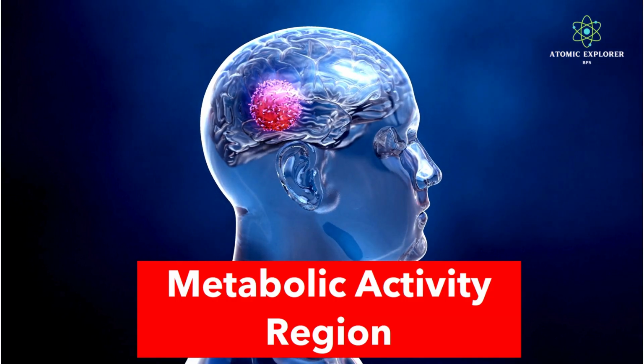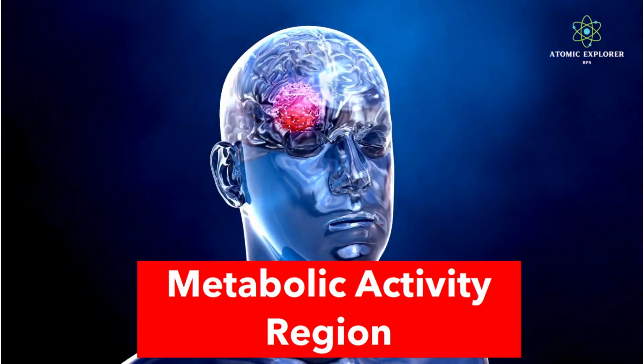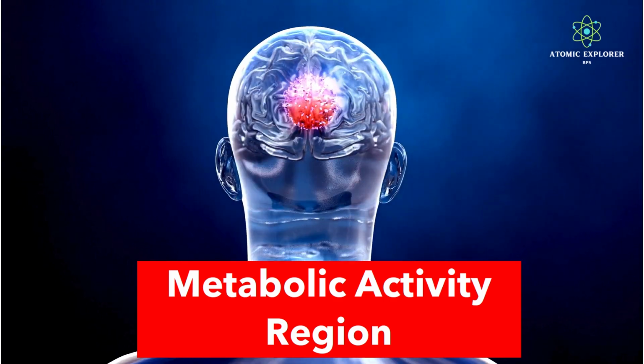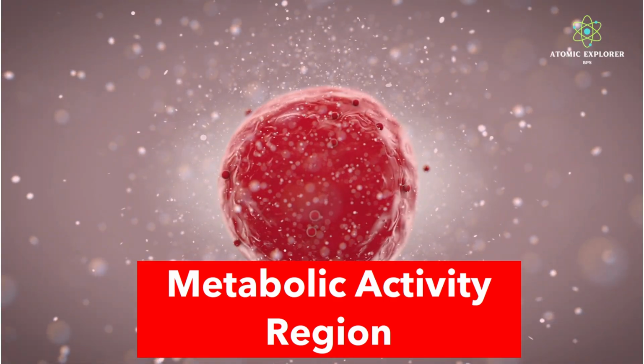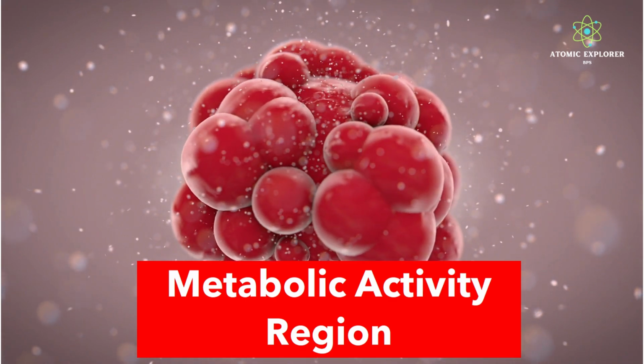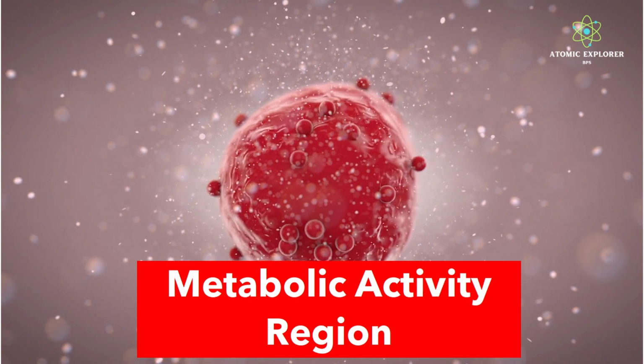They take up this FDG sample. This uptake is crucial for PET imaging, allowing the scanner to accurately detect the locations and intensities of radioactive emissions.